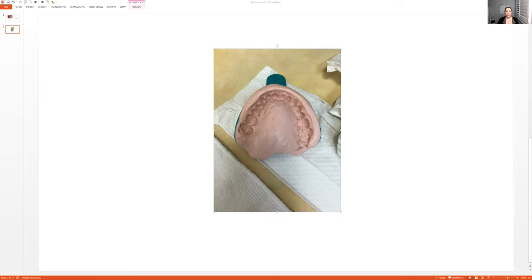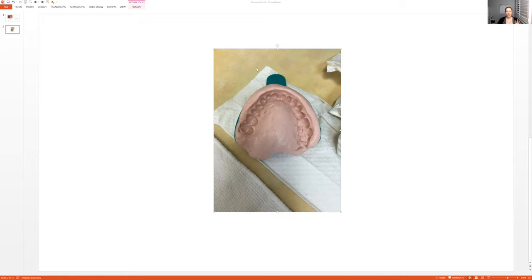But it's also hard to take a perfect alginate impression. Don't just throw it out or toss it aside if it doesn't look like this. If you're not sure, show it to the dentist. But I just wanted to show you guys what it looks like if it's perfect. This is an alginate impression.